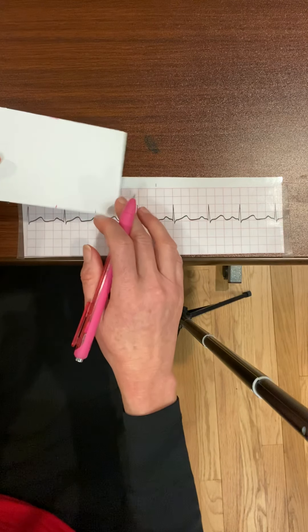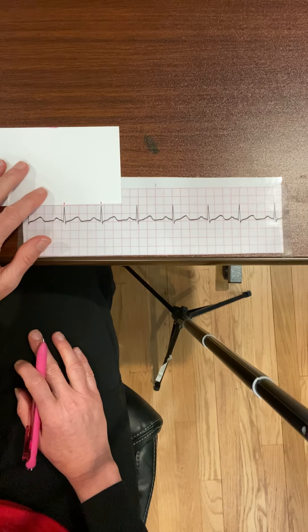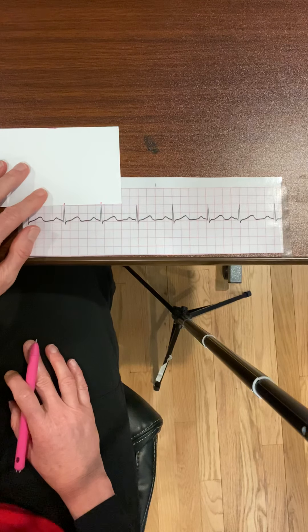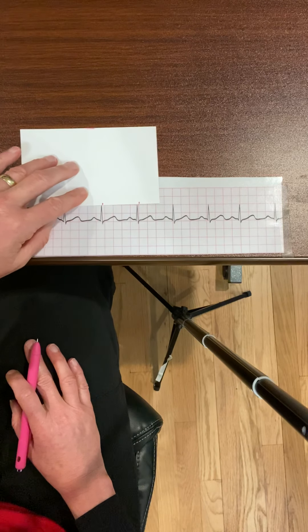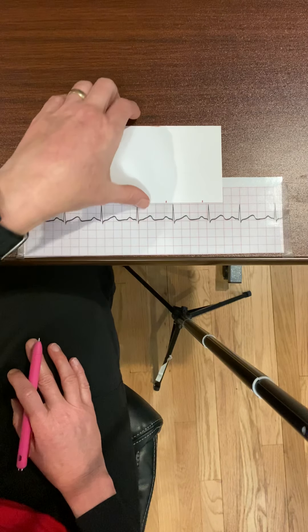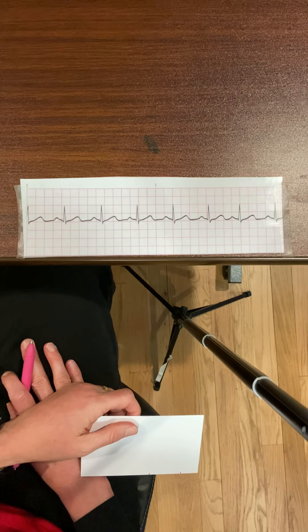I can do the same thing with my QRS complexes. I flip the card around, draw a little line at the top of my QRS complexes, and march it out — this is called the R-to-R interval. My R-to-R intervals are regular, so my ventricular rhythm is regular. I can say that this rhythm strip's rhythm is regular.